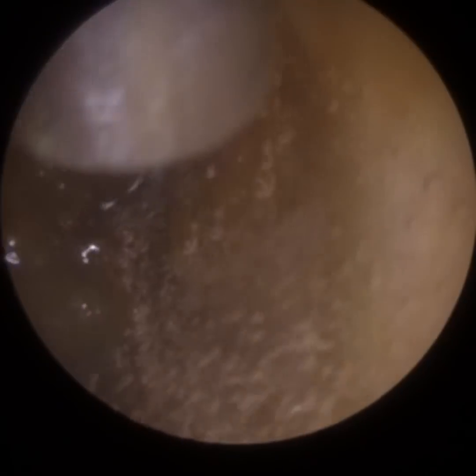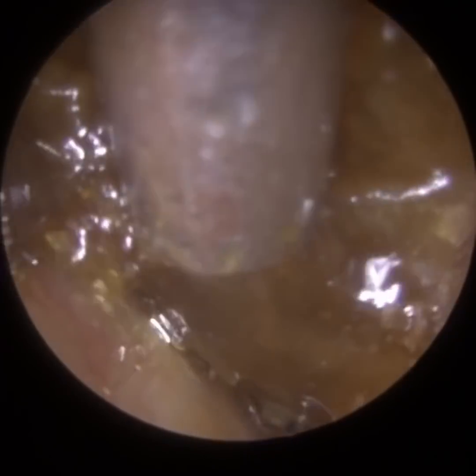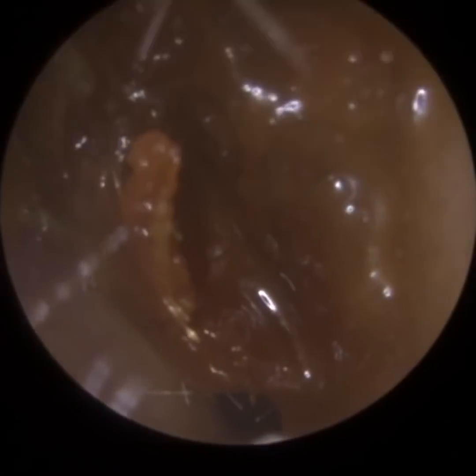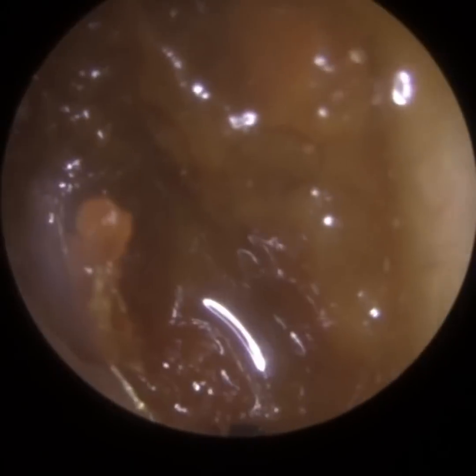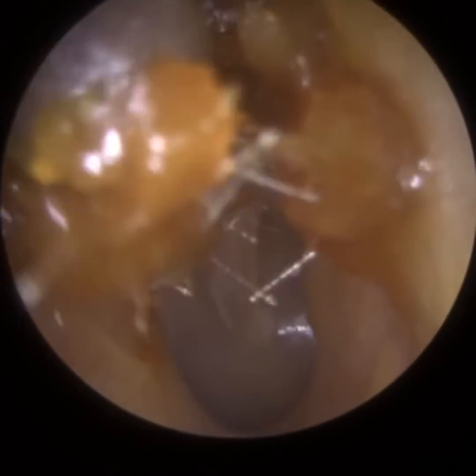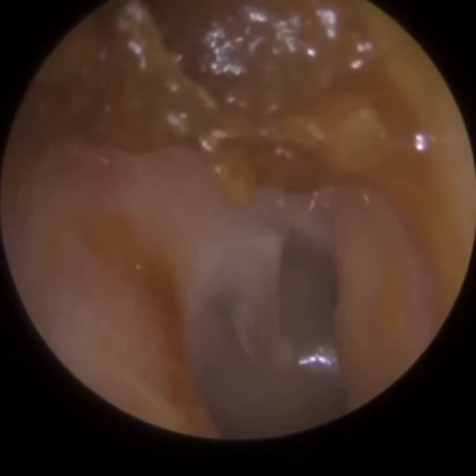When I first started using olive oil spray or drops during the procedure, I used to soak the ear first and let the drop stay in the ear for a few minutes, then get the patient to tilt the head the opposite direction to drain it, and then I would go back in and suction the wax out. More and more often now, though, I'm actually suctioning and performing the procedure whilst the oil's in the ear. It's a bit more tricky because I have to stand up a bit. I have to get off my medical stool because the patient's head's tilted across a bit.